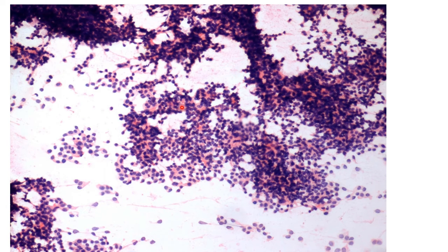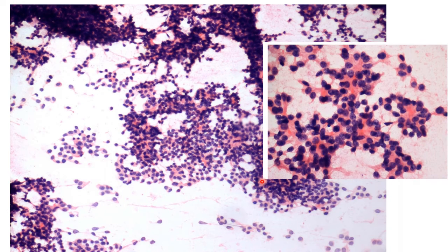Here again, you can make out these rosettes, these little ones here, and the cells are round to ovoid with a speckled or stippled chromatin. The rosettes have been highlighted here as well. So you can easily make out these rosettes, very characteristic of an ependymoma.